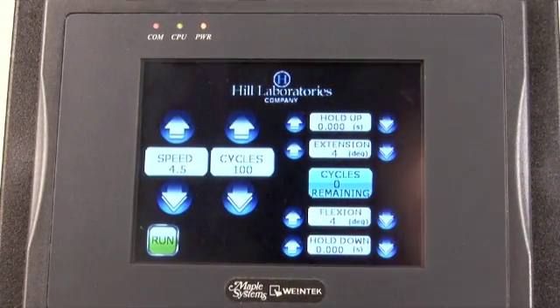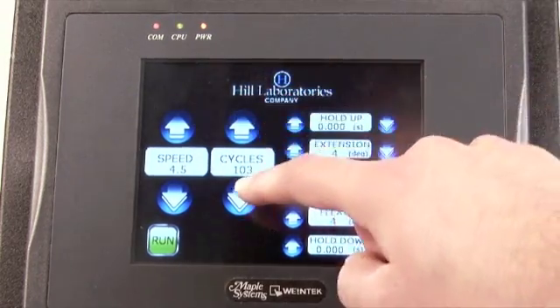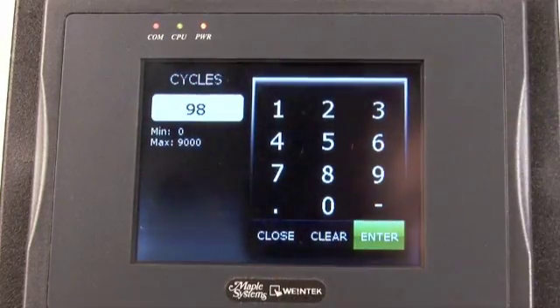The cycle setting refers to the number of full up and down cycles in a treatment. To enter an exact amount, press any settings button for keypad entry.